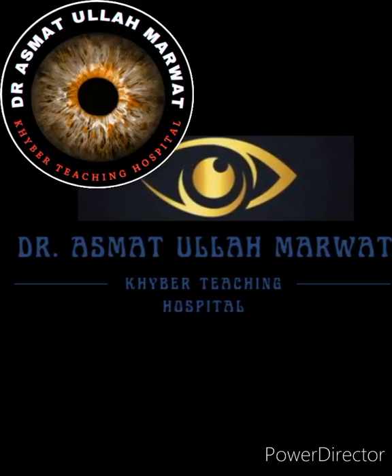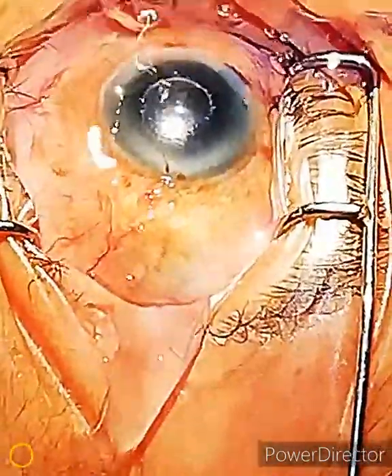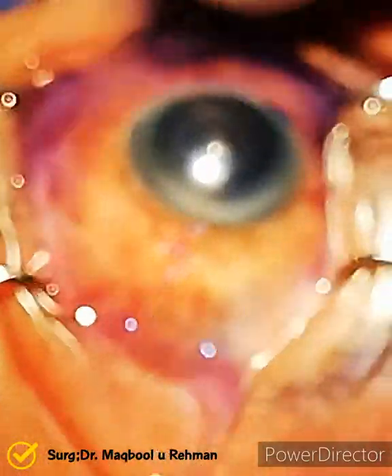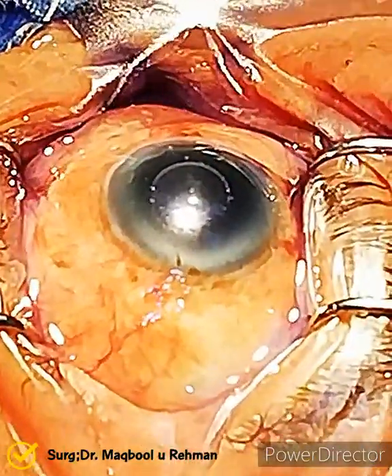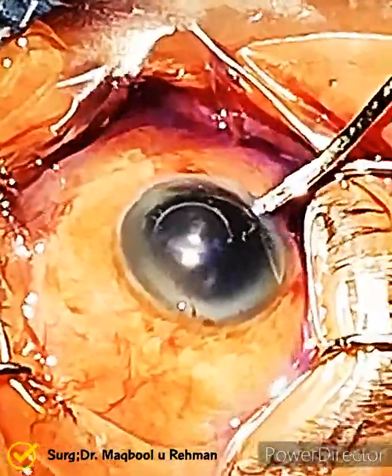Hello everyone, I am Dr. Asmatullah, and today we will watch a case of intumescent cataract with an intraocular pressure of 34 mmHg. This was a 97-year-old man who was suffering from bilateral intumescent cataract. We did the left eye first.